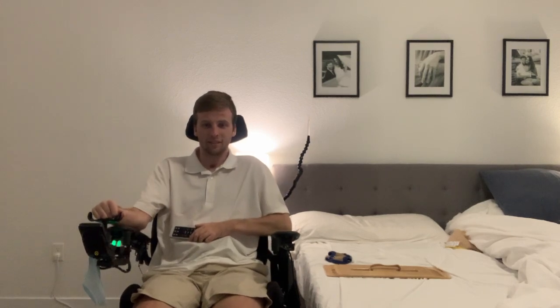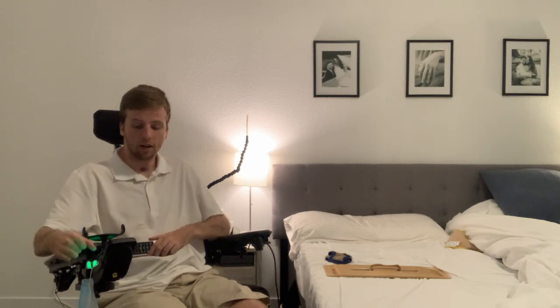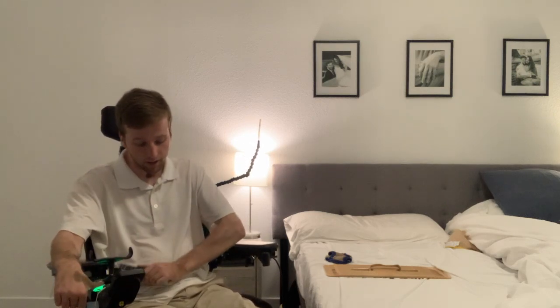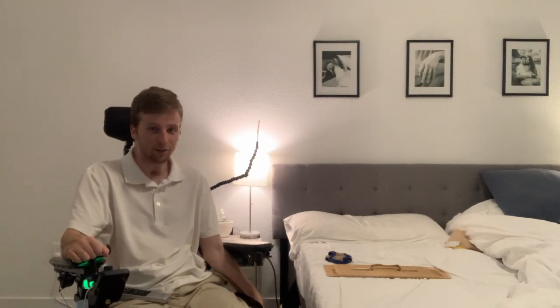Hey guys, tonight I'm going to show you how I transfer independently as a C5/C6 quadriplegic. I've got a split king adjustable bed which is super helpful — it goes up and down, which is really convenient for transferring from this chair or my manual chair. It helps me level out the bed to where I transfer, so it's super nice.